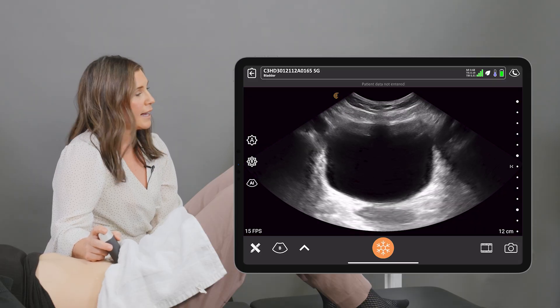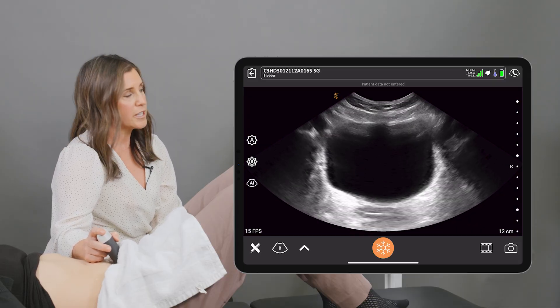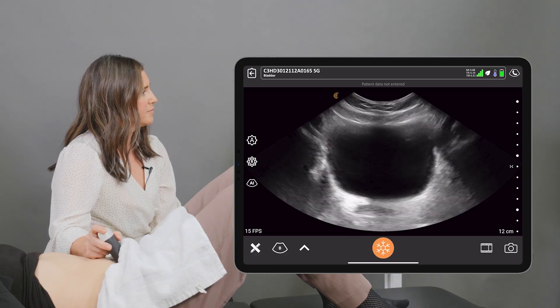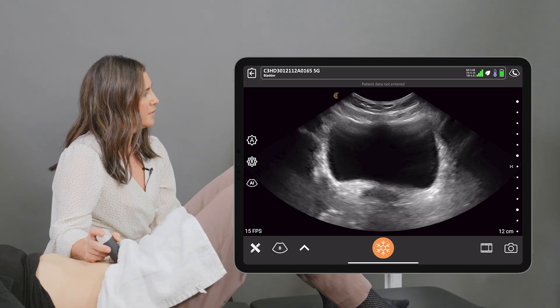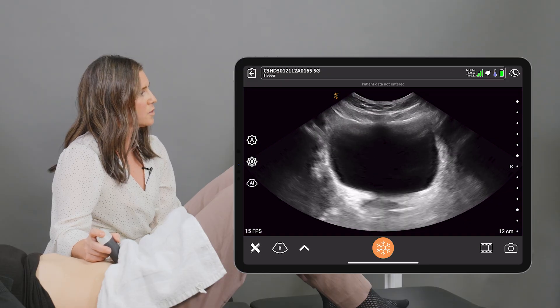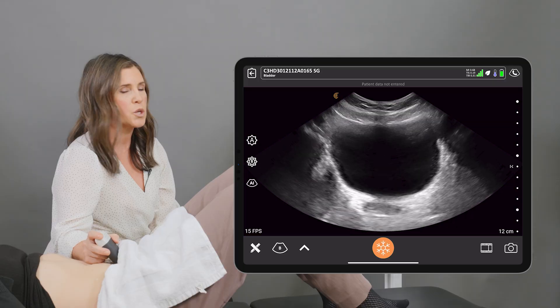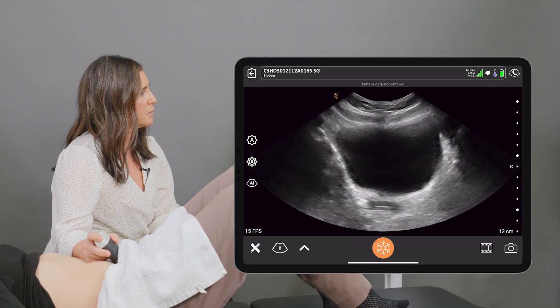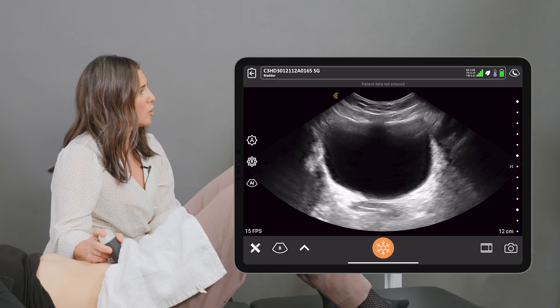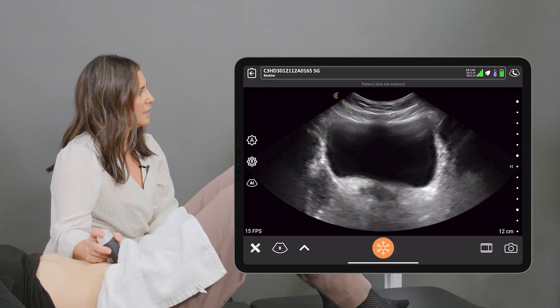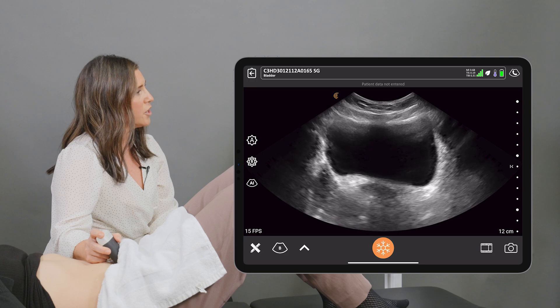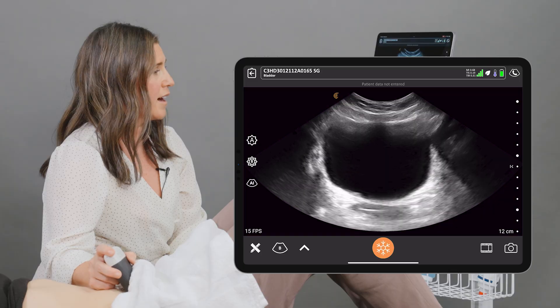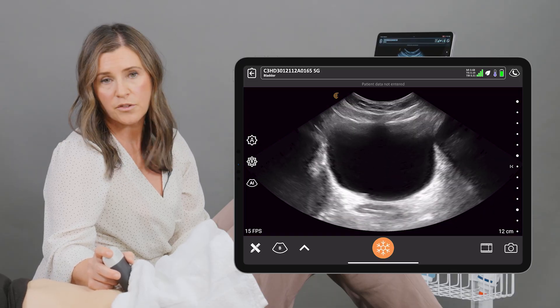Then we're going to get the client to do a pelvic floor contraction and a relaxation, and we're going to do that again and then let that go. We're observing the quality of the contraction — a normal response should be an elevation of the bladder base. We're also looking at whether that lifting of the bladder base is symmetrical or if there's some asymmetry, and then we're also looking at the quality of the relaxation.